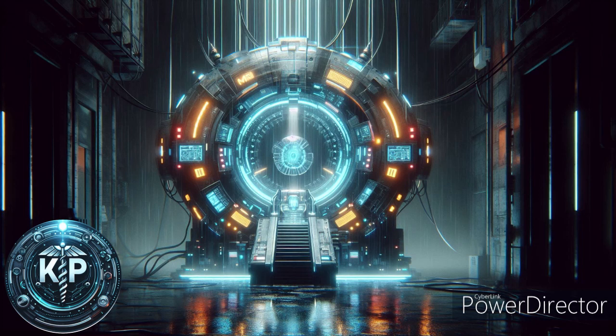Siting. This refers to the location and construction specifics of the MRI suite. Proper siting is crucial to accommodate the magnetic field, reduce vibration, and ensure safety.